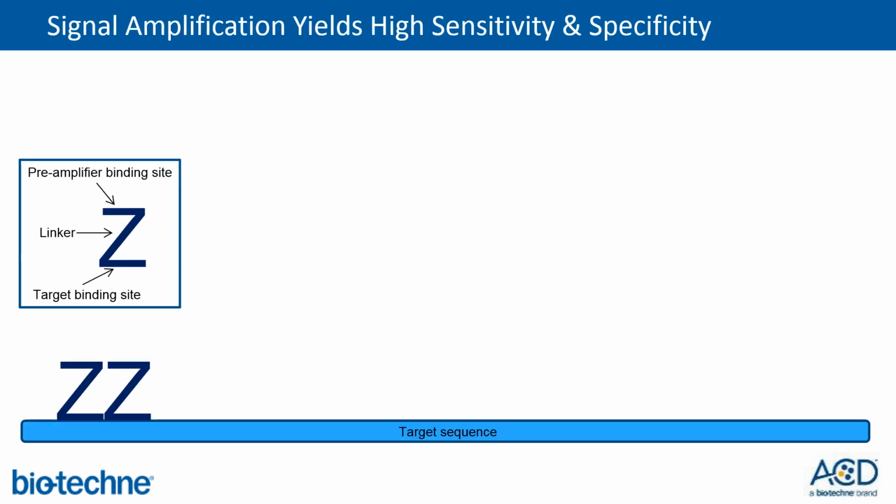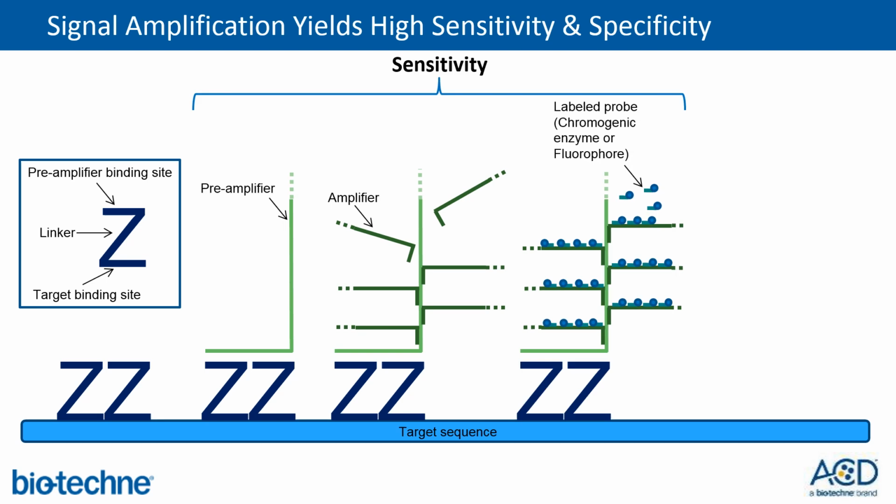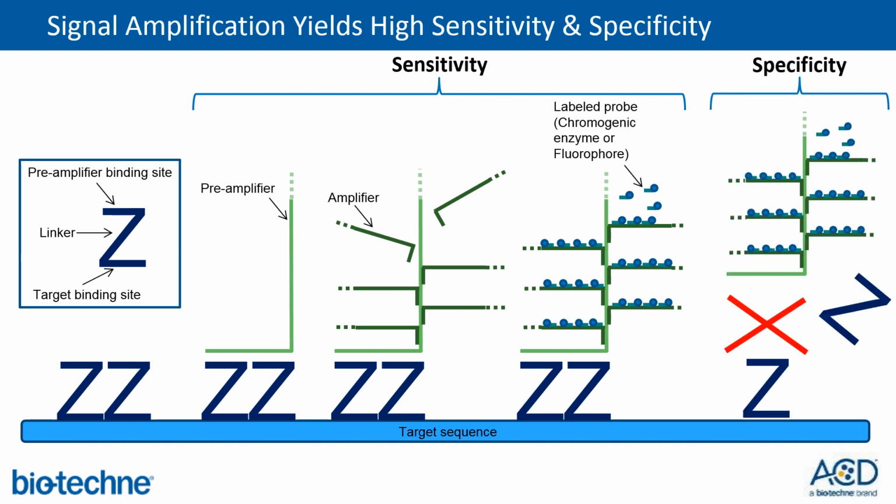Both assays use the same signal amplification methodology. Paired oligonucleotides hybridize to a target sequence, whether it be an AAV vector or transgene transcript. Signal will be amplified when two oligos hybridize to the target sequence and then also simultaneously hybridize to a preamplification module, which will then hybridize to amplification oligonucleotides and then labeled oligos for signal detection. This amplification only occurs when multiple oligonucleotides are hybridizing at the same time in the same place, which is how we avoid any background in this assay.